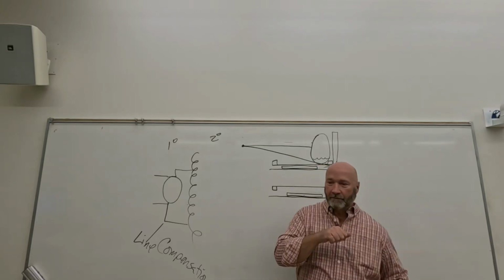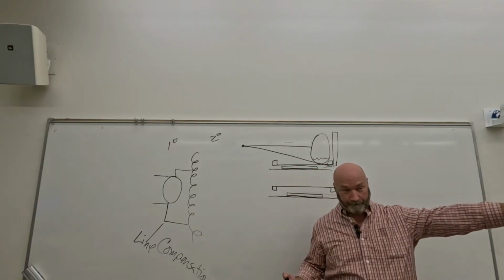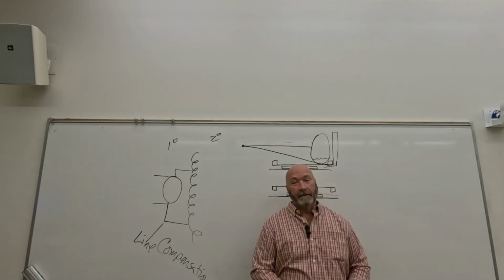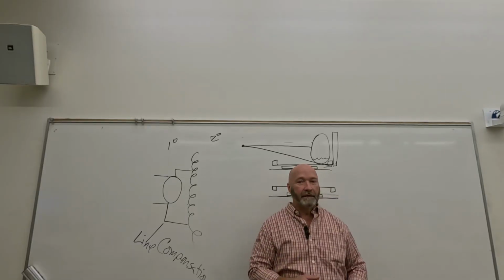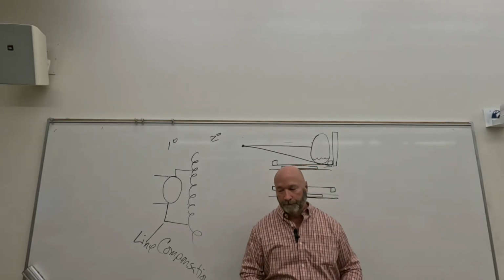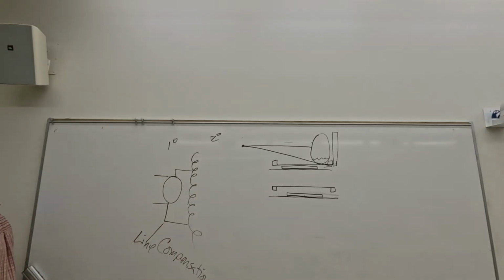But I pointed the x-ray tube directly at that glass, took a film, stuck it up against the glass where it was pointed and made an exposure, and I got nothing. Which makes no sense to me because I can see through that glass, but it is radiopaque enough that it absorbed every perceivable x-ray that hit it. So you're not getting much behind the control panel, if you're getting anything. So all walls have to be shielded.